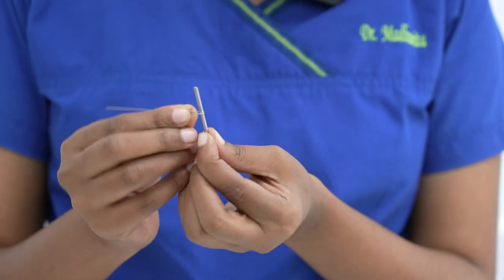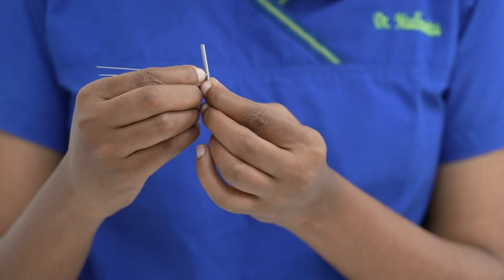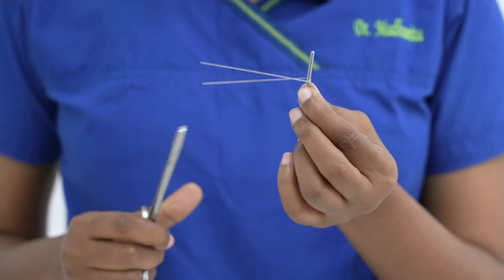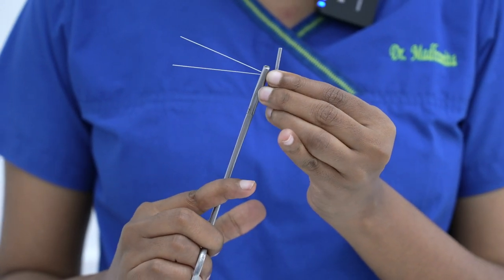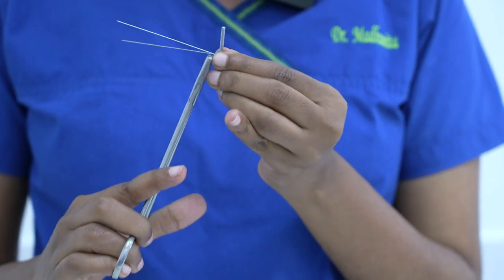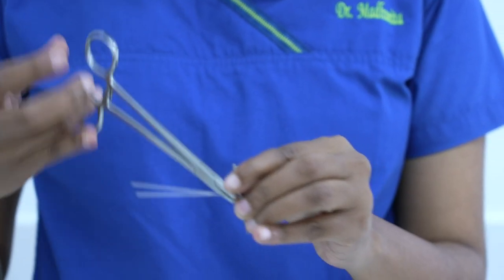This is what I get after my two loops — I have wound the wire around the burr. Then you secure your needle holder about a few millimeters away from the burr and make two and a half turns.